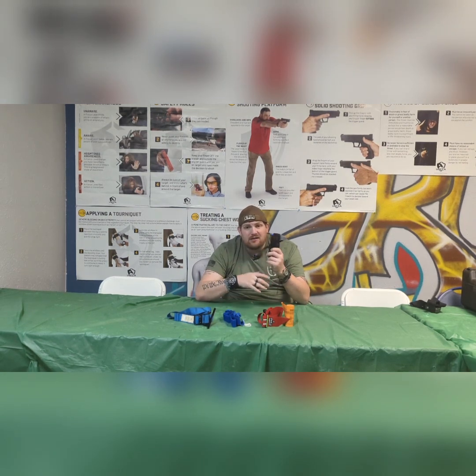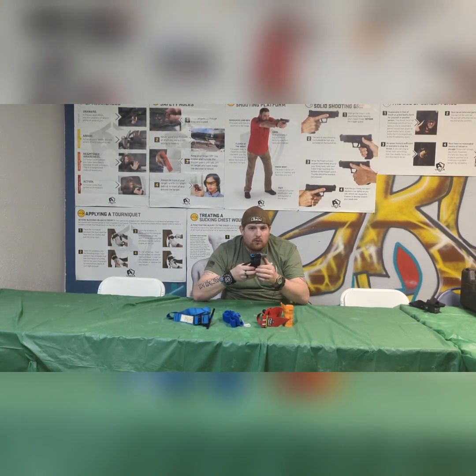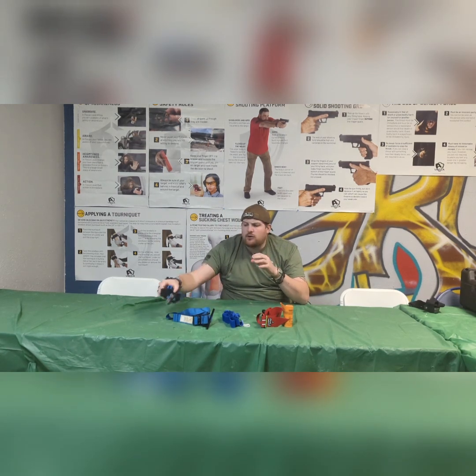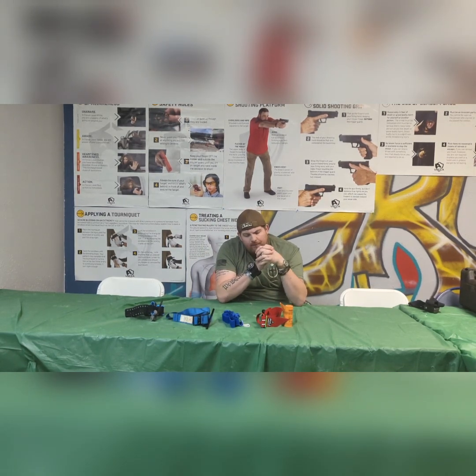I recommend you buy a trainer. Yeah, they're expensive, and trust me, they're expensive. But there's no point in you training if you have it and you don't know how to use it. With a trainer, at least you can wear and tear it and break it and not break your real one, then be out of a tourniquet. And obviously, you don't want to be training with your real thing because then it compromises it. So buy a trainer, guys. Buy a trainer, please. Whoever's watching this, please buy training tourniquets. They're great. Use them. It just makes you better.